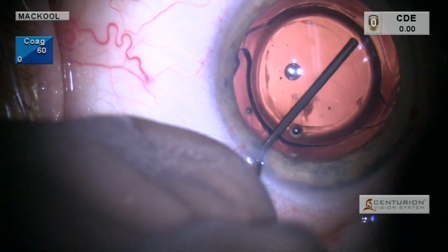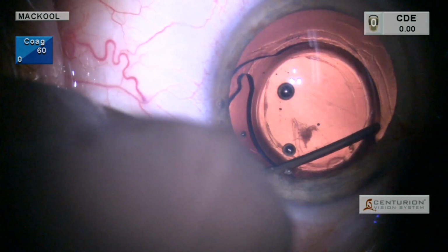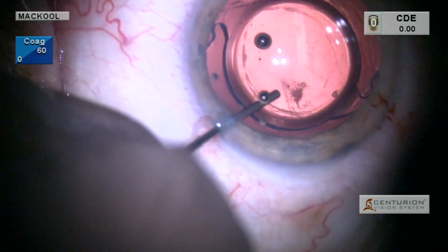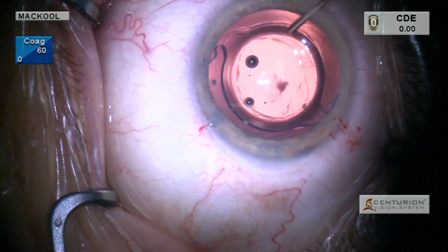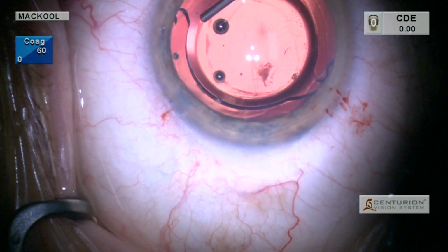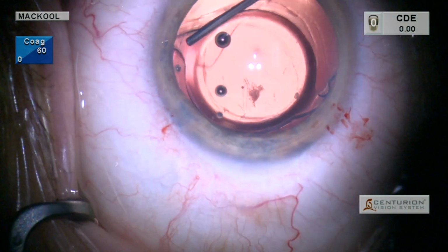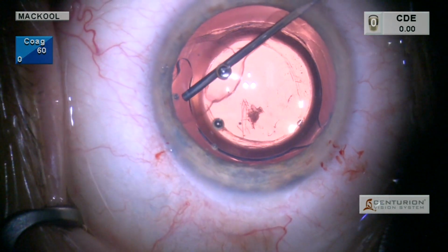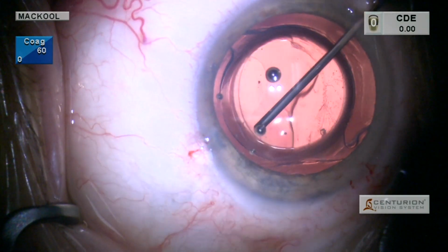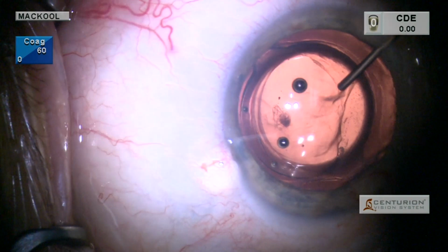So now through this side port, doing the same thing now with a cannula, trying to get some visco dissection and freeing of the optic from the surrounding capsule. And you can see the OVD moving out into the periphery there. Not necessary to free the haptics. In fact, we don't really want to free the haptics. We want to free the optic.